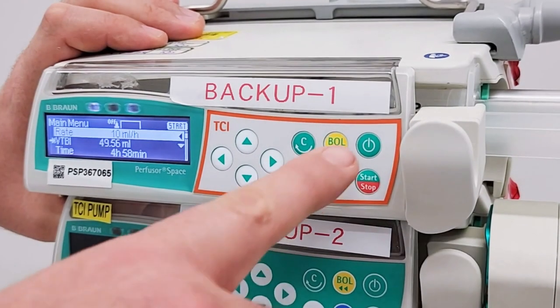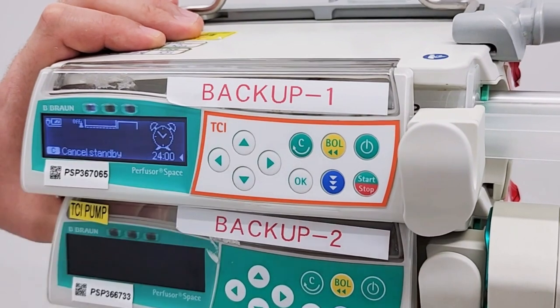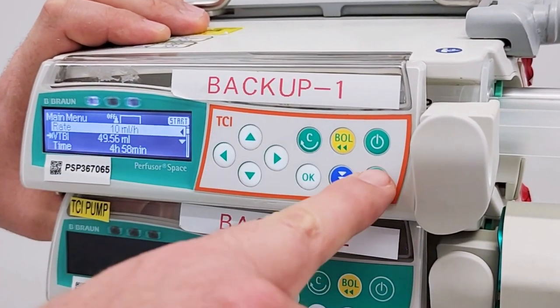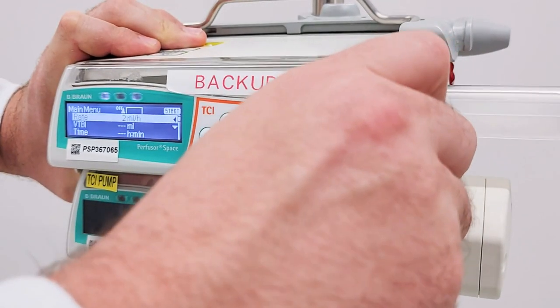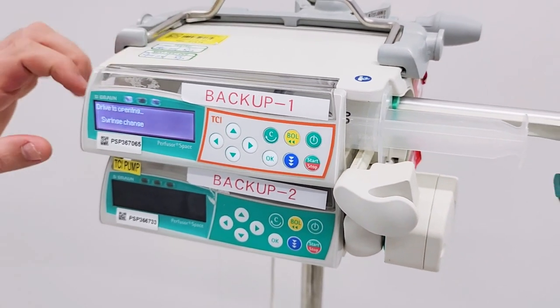To put on standby mode, first press the on-off button, then select yes. Press C to exit standby. To switch off the pump, take the syringe out of the pump and press the power button for three seconds.